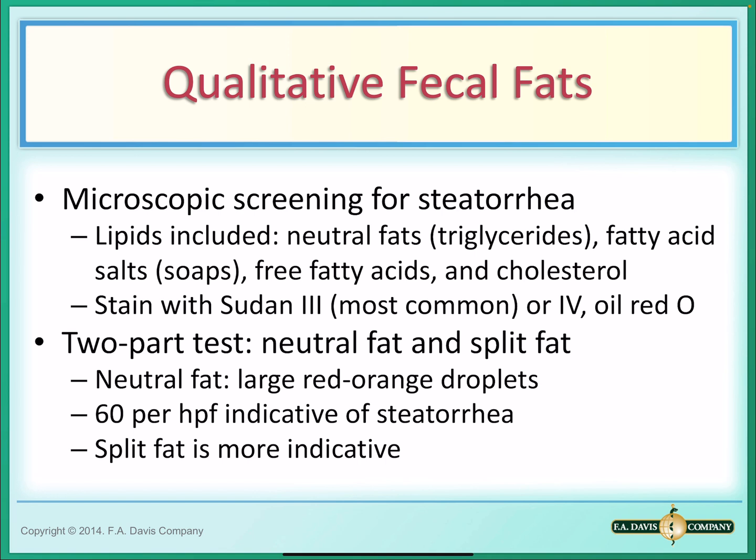Now let's talk about qualitative fecal fats. Specimens from patients suspected to have steatorrhea can be screened microscopically for the presence of excess fat. Remember, excess fat in the stool is called steatorrhea. Also, the procedure can be used to monitor patients undergoing treatment for malabsorption disorders.